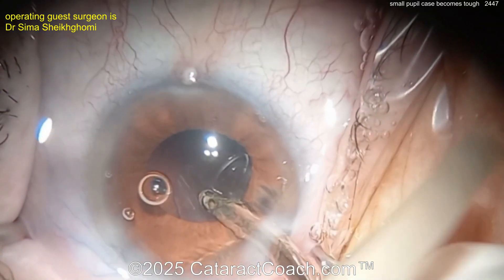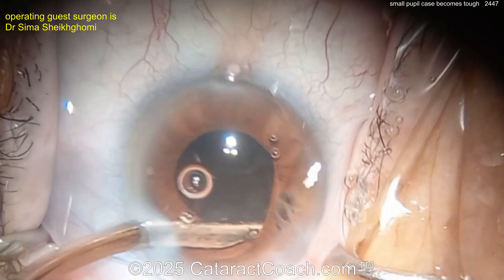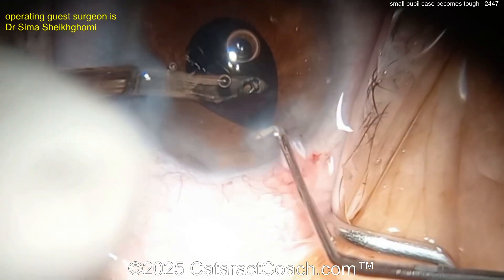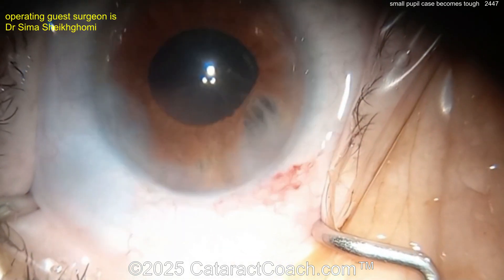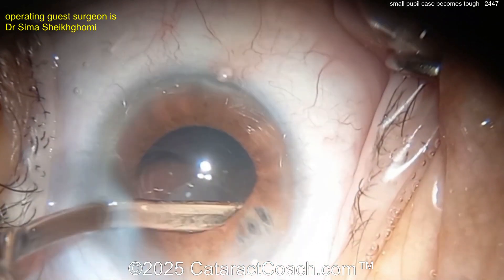The case looks pretty good — cleaning up the rest of the cortex. Let's get the lens in the bag. There's that iris defect — you'll definitely see it. If you're a surgeon and you see this patient with an iris defect in the first eye done elsewhere and now doing the second eye, give the other surgeon the benefit of the doubt.